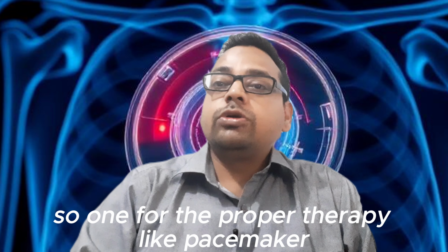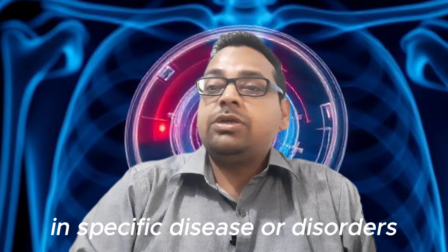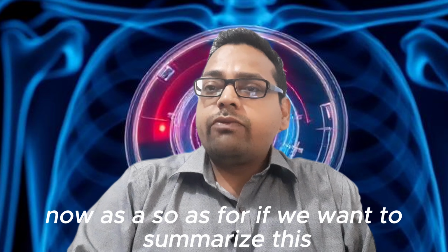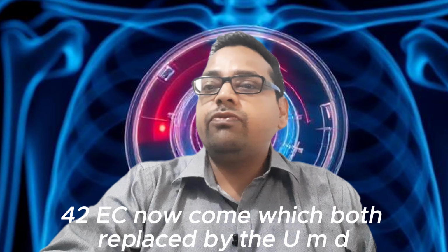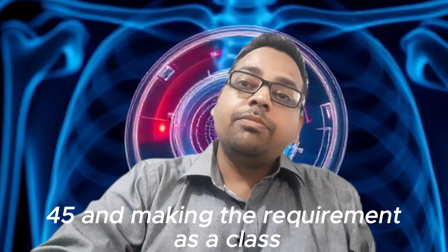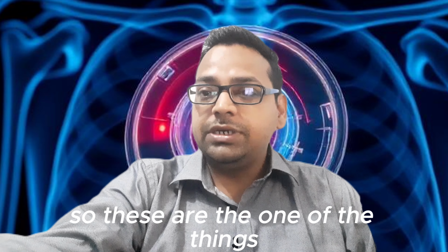So one is for therapy, like a pacemaker, which helps in regulating the heartbeat, and another is for diagnosis of specific symptoms and conditions in specific diseases or disorders. That is a few things about active implantable medical devices. To summarize, active implantable medical devices earlier came under 90/385/EEC and 93/42/EEC, both now replaced by the EU MDR 2017/745, making the requirements the same as class 3 medical devices. So active implantable medical devices and class 3 medical devices have the same requirements.